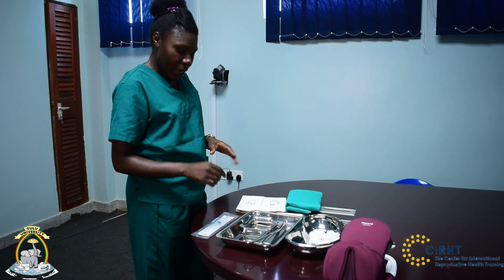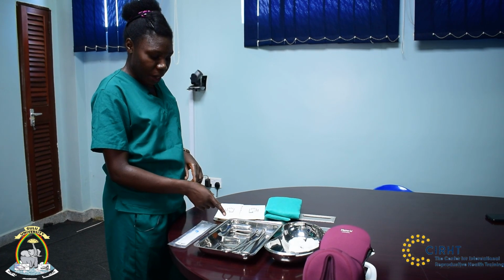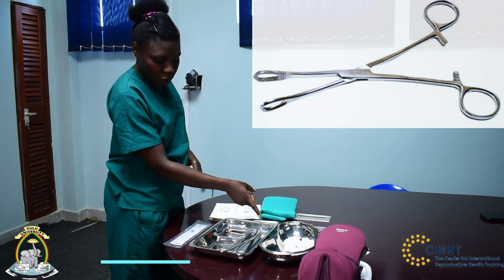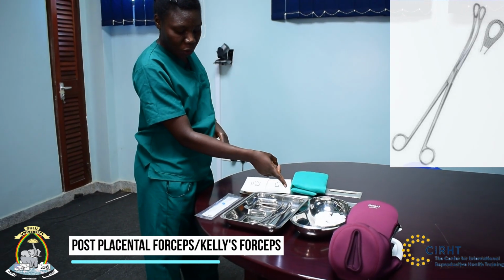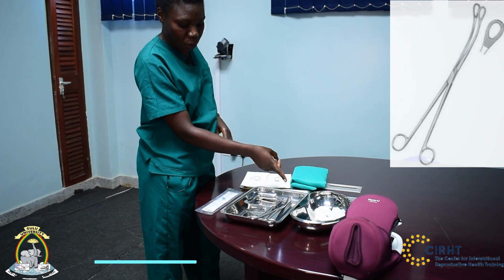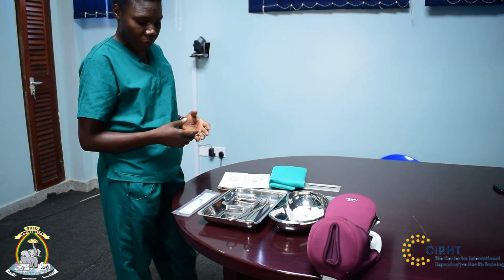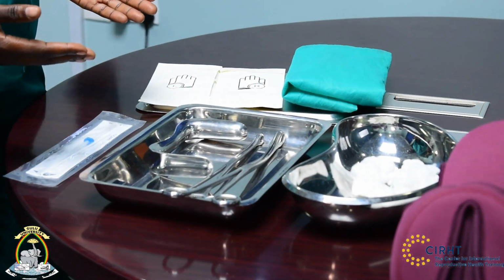So we have a number of instruments or requirements that we need for this procedure. Number one, we need a Sims speculum. This is our Sims speculum. We need a sponge holding forceps. We need special Kelly post-placental forceps. Or sometimes we do not have the Kelly forceps, we can also use ring forceps instead, but we would prefer to use Kelly forceps because they're long and they make the procedure easier for you. All these are sterile instruments.